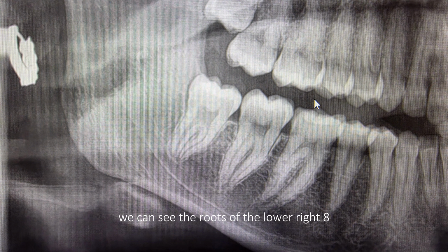Looking at the OPG, we can see the roots of the lower right 8 are separate from the superior border of the ID canal. The bone appears to be of soft to moderate density. This is in keeping with the age of the patient, who was in her late teens, and there was distal chronic infection behind the tooth, which sometimes makes it easier to remove the tooth through elevation.